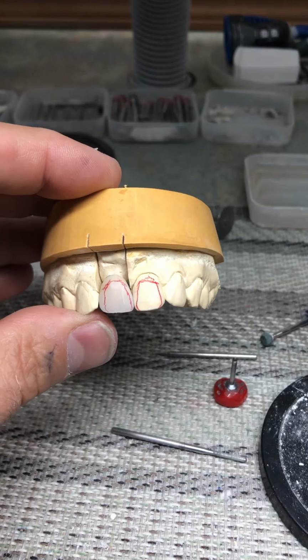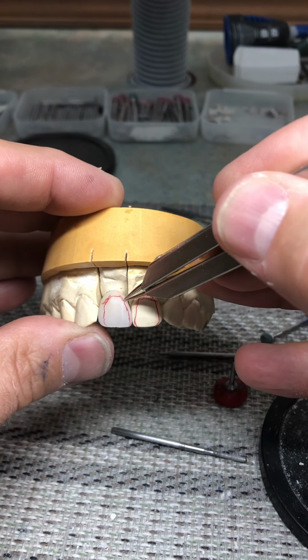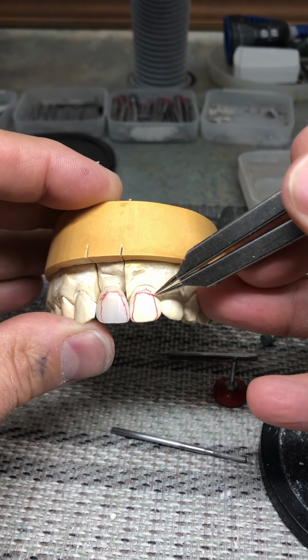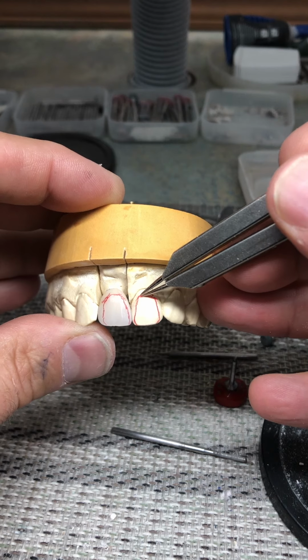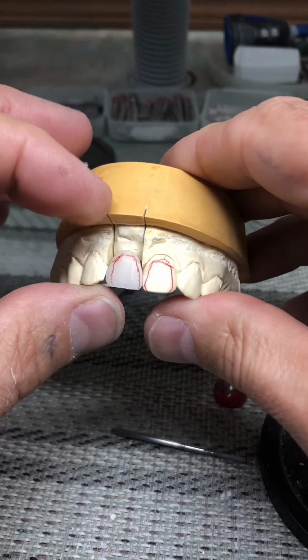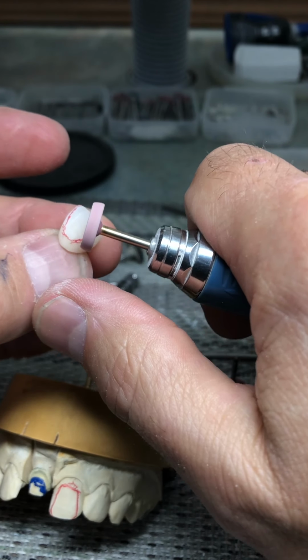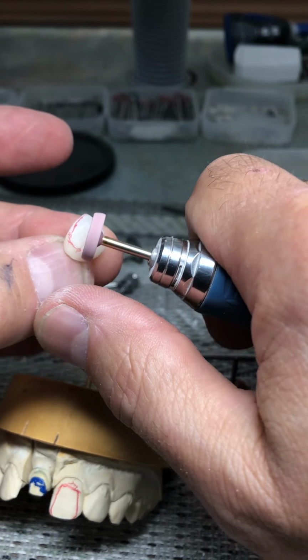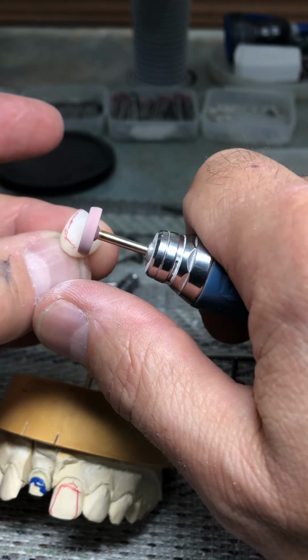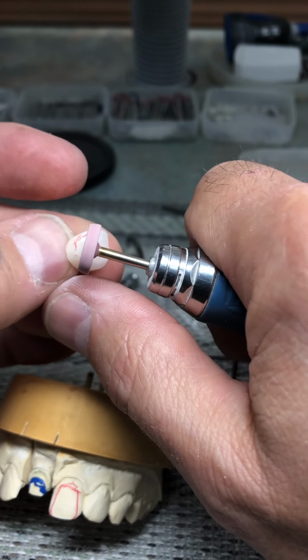It's better, but right now I do not care for this curve here. This is more horizontal, with the zenith being on the mesial. This is sort of curved with the zenith being right in the center now. So we'll see how we can alter that. Obviously we need to think about emergence profile and the general shape of the tooth as we do this.